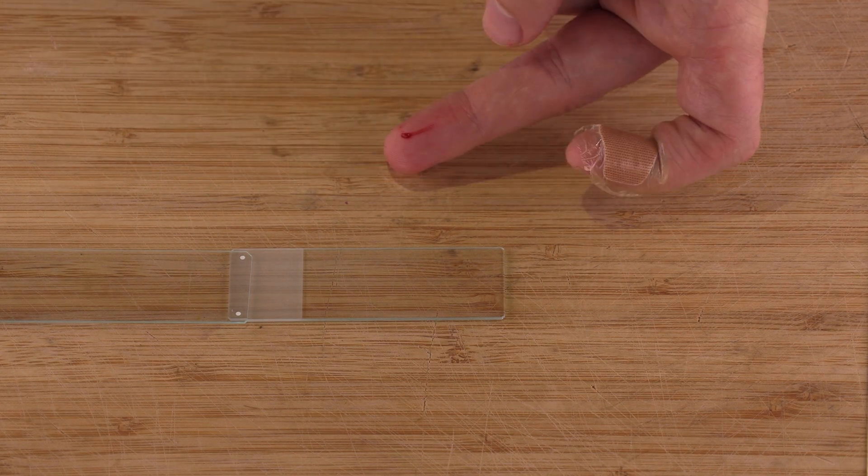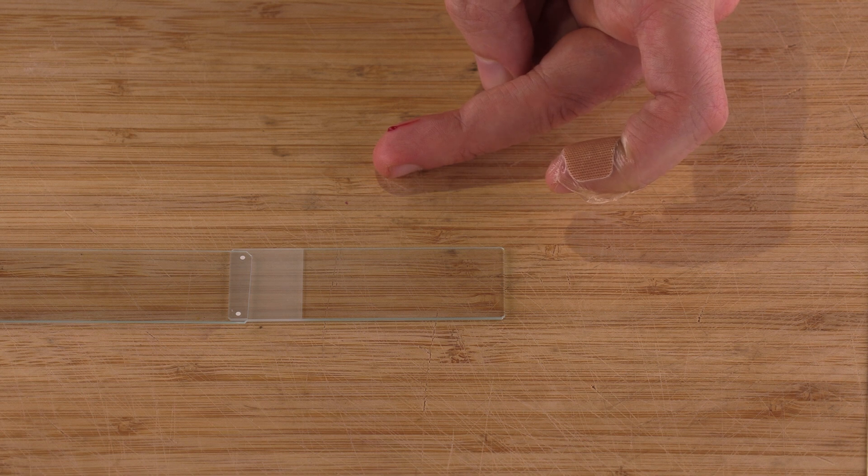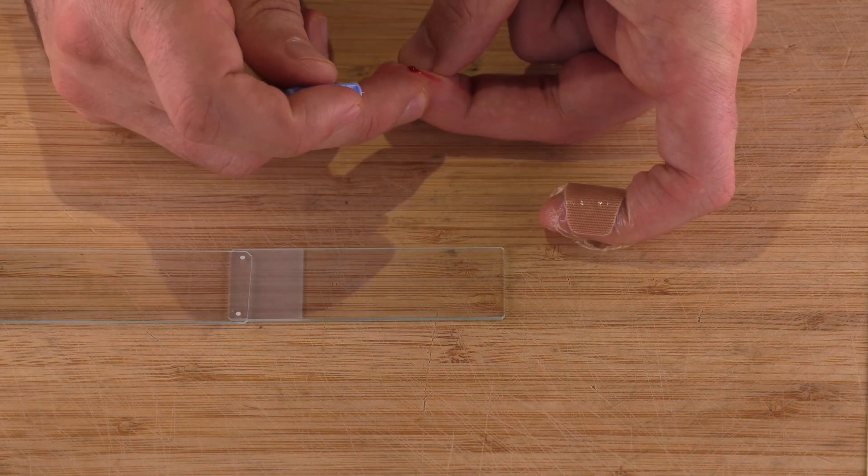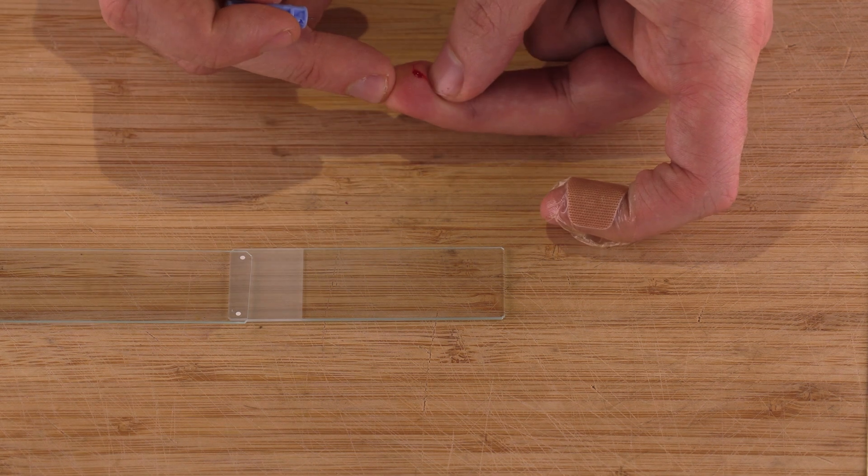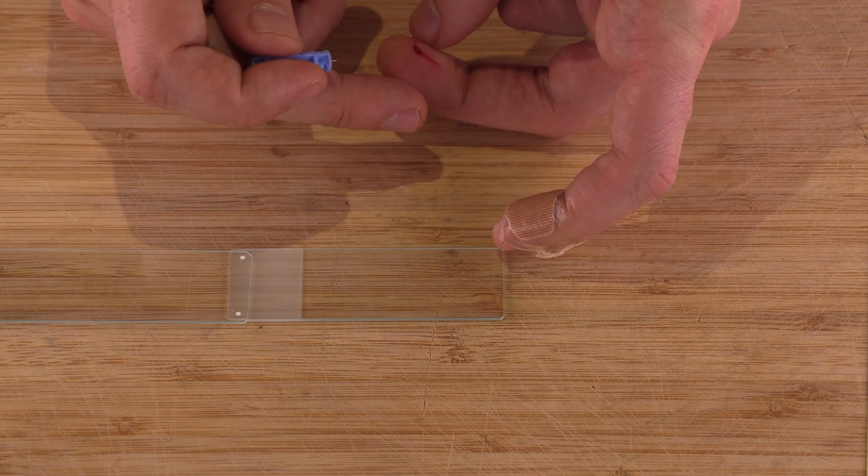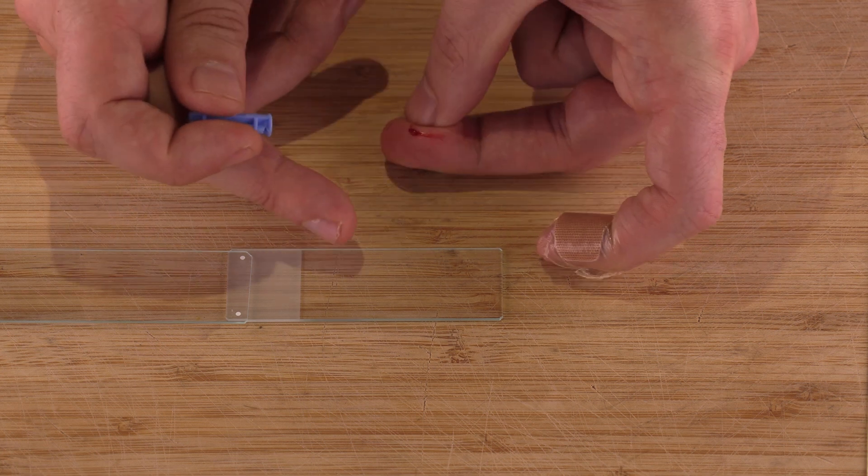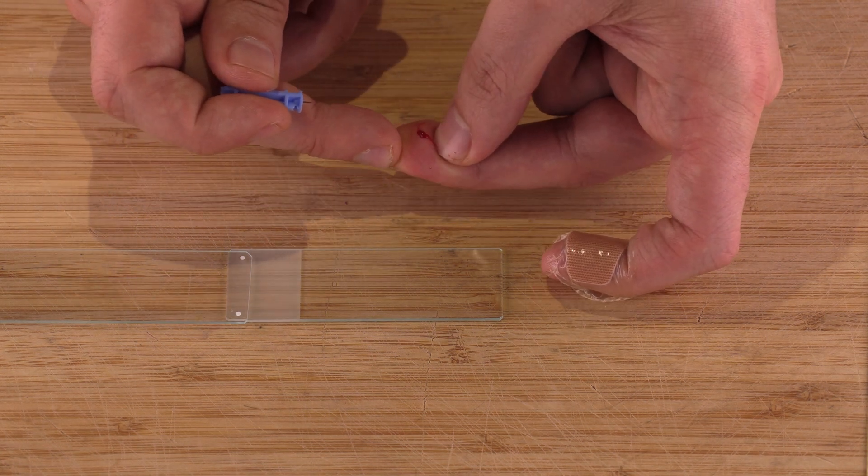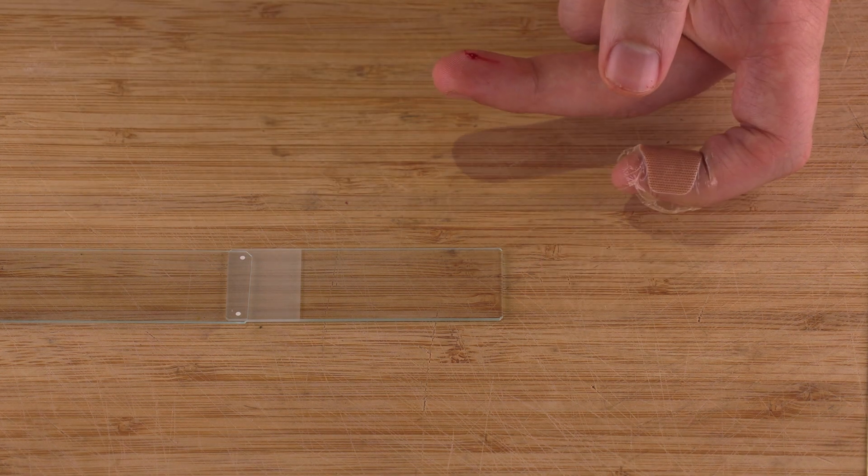I'm looking for a proper drop and you can see it's sort of got a little bit of that drop shape. It's not perfect yet but just trying to get a nice drop that's going to transfer to the slide better. I'm looking to get it to bead up a little bit and it's going to transfer to the slide better that way.